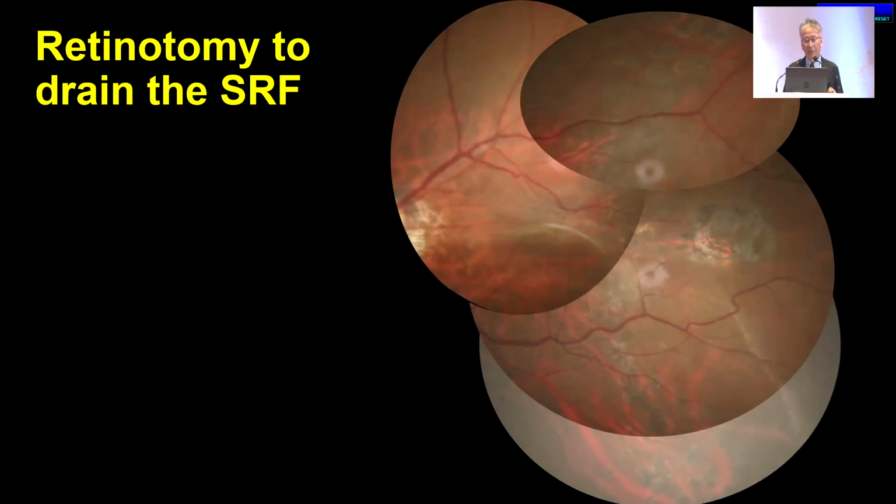So if the fold is not great enough, and it's at the side of the macula, in an extramacular area, then probably you can make some retinotomy here and drain some fluid, but still the slippage is folded, and then you have an epiretinal membrane, a large pucker, for these patients.